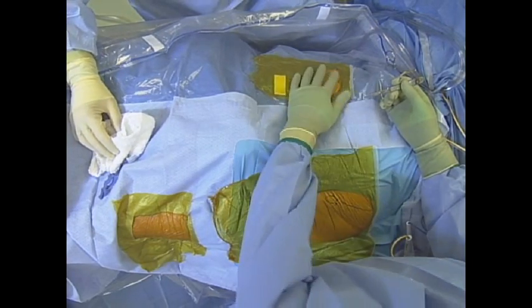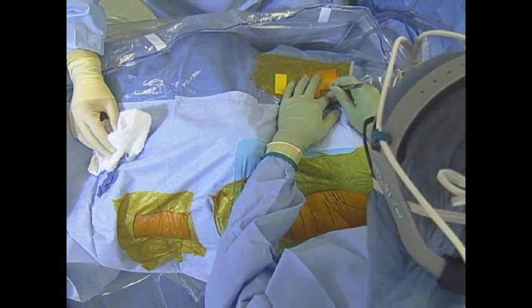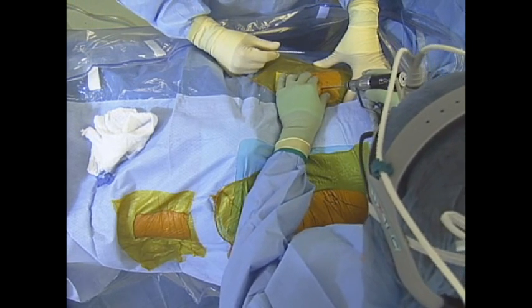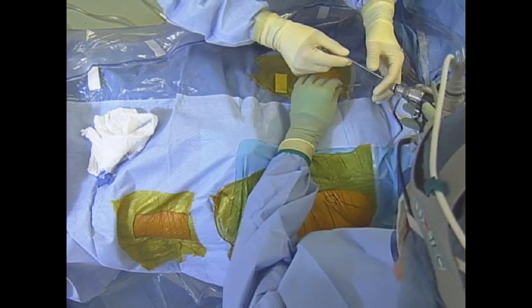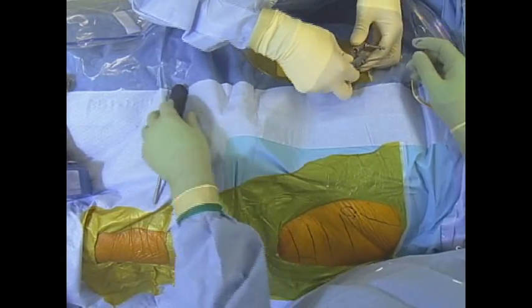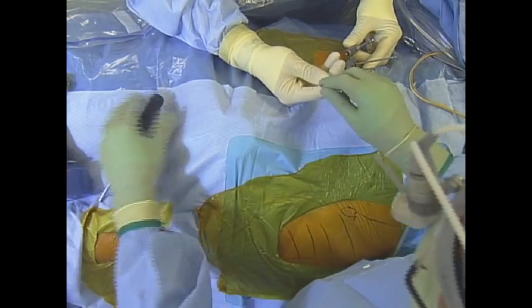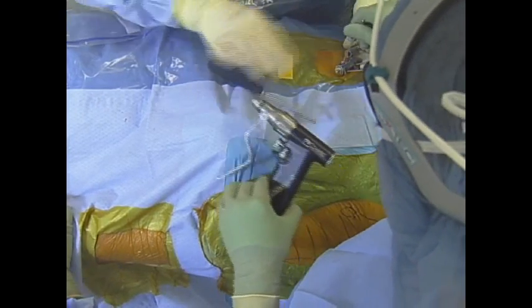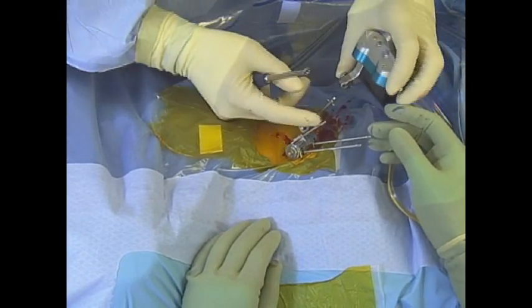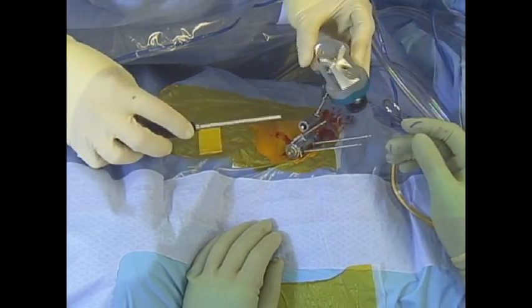For navigation, we put the tracker on the opposite iliac crest — that's why we draped it out here. We make three small poke holes for the tracker. You find the iliac crest and go between the two tables, put it in a good ways, make sure it's stable. We put the ortho lock on such that you can tighten the screws — if you put it the other way you have to tighten from over here, which can be challenging. We always put a third pin in because we really like the stability that three pins give us. These trackers have such a good range that it's not any issue of where you put it to get it seen by the camera.